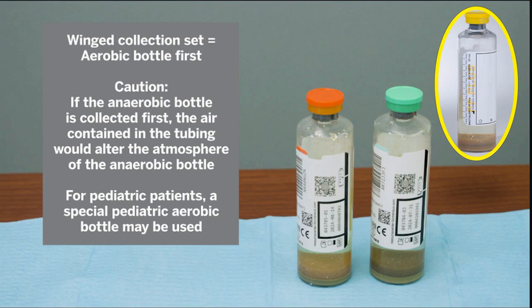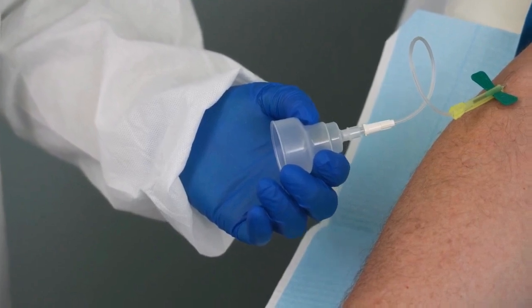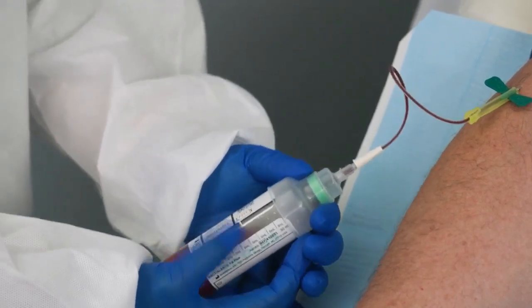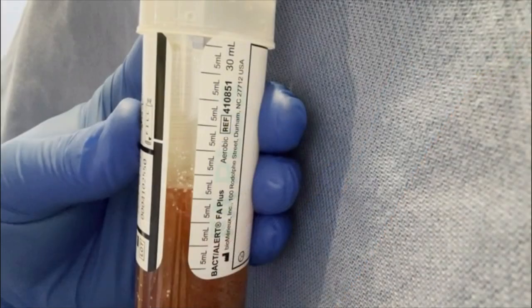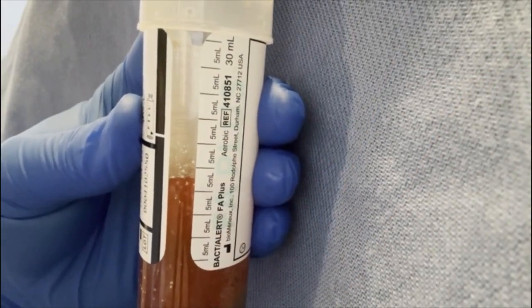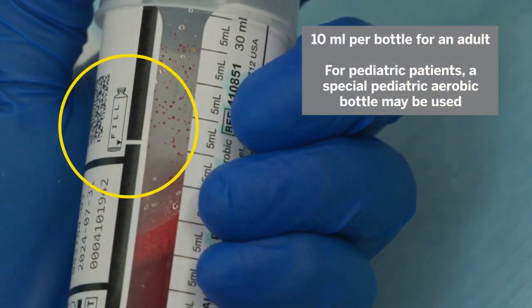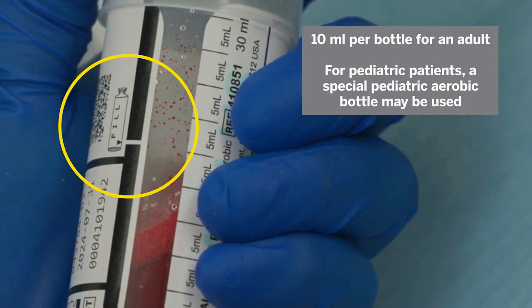For pediatric patients, a special pediatric aerobic bottle may be used and inoculated with up to 4 milliliters of blood. Grasp the adapter cap always by the outer edge and don't put your finger into the center. Place the adapter cap over the aerobic bottle and press straight down to pierce the septum. Continue to hold the adapter cap down during the collection. Keep the bottle in an upright position below the patient's arm during the collection to avoid backflow of media into the tube. Use the fill-to mark to accurately gauge the sample volume — 10 milliliters per adult bottle. The vacuum inside the bottle will not stop at 10 milliliters, so be sure not to overfill.